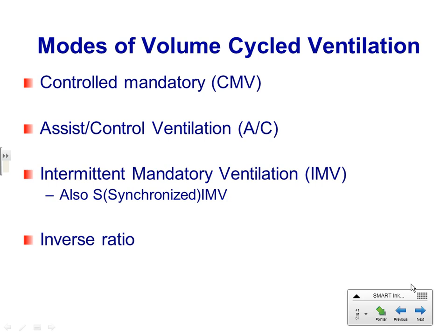High frequency, again, very uncomfortable. They can get small tidal volumes anywhere from 60 to 200 breaths per minute. So those are patients that have very poor lung compliance. Their lungs are very damaged. They can't tolerate high tidal volumes, so they're getting small amounts of air being forced in at a very high rate. Again, very uncomfortable. These patients are going to be sedated as well. These are the very, very sick patients.